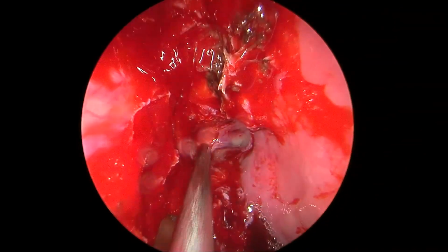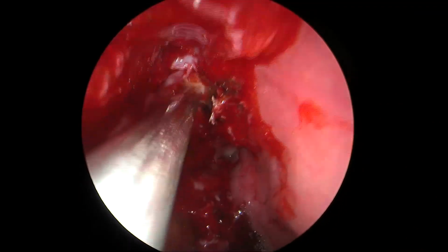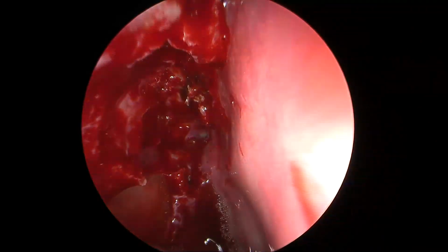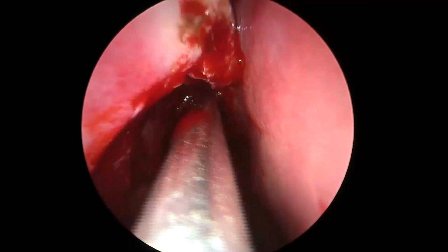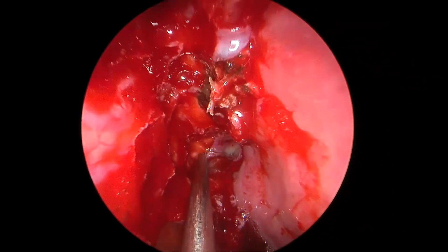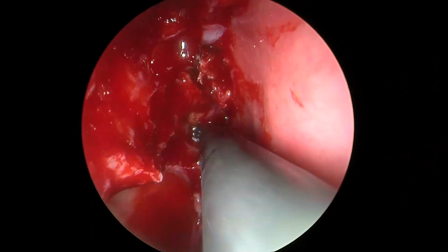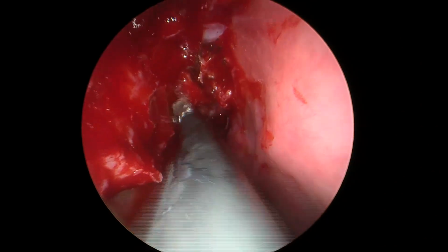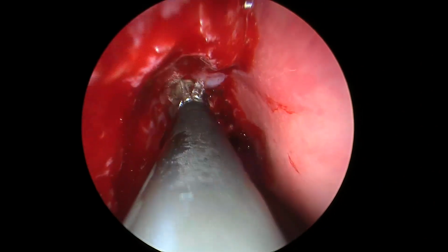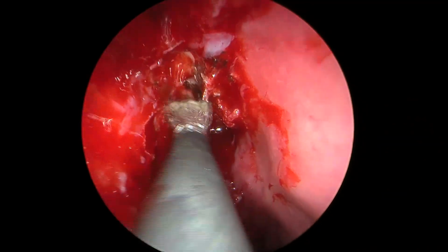You can see the sphenoid sinus here in the front, the maxillary sinus, and we always make sure that we have not taken down the sphenoid sinus so low as to injure the septal artery. Though we are not reconstructing using the septal flap here, we always prefer to keep the septal flap in place as an option should there be contingencies later in these patients, or recurrent leaks or leaks at some other area. So we always make a point to preserve them.